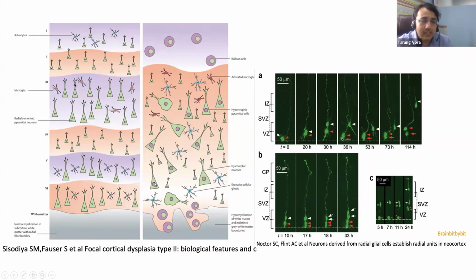The balloon cells are basically cells which have a lot of cytoplasm in them, and because they have a lot of cytoplasm, they have a lot of water in them, and a lot of water basically means that we're going to catch some good signal on MRI, very good quality MRI, on the T2-weighted and the FLAIR sequences, because the water content is more compared to an average brain.